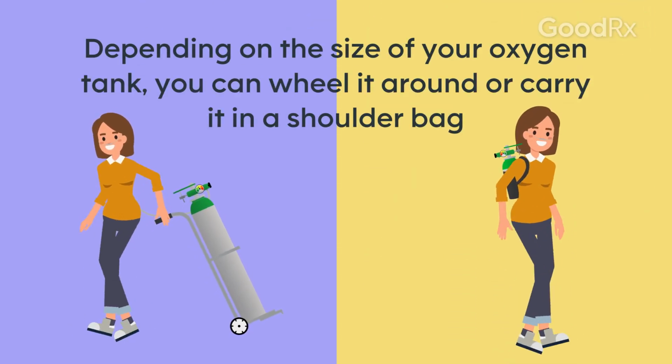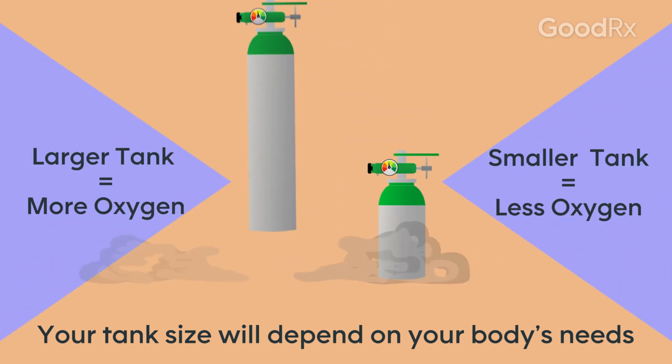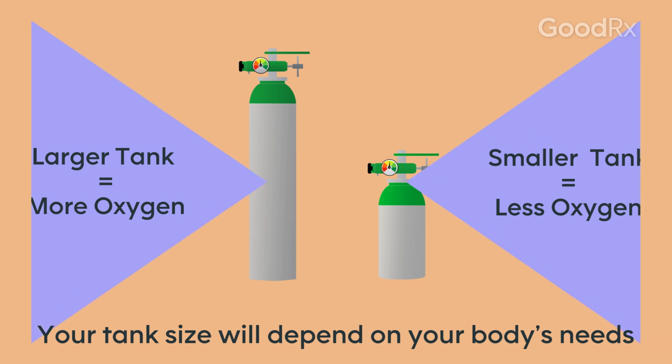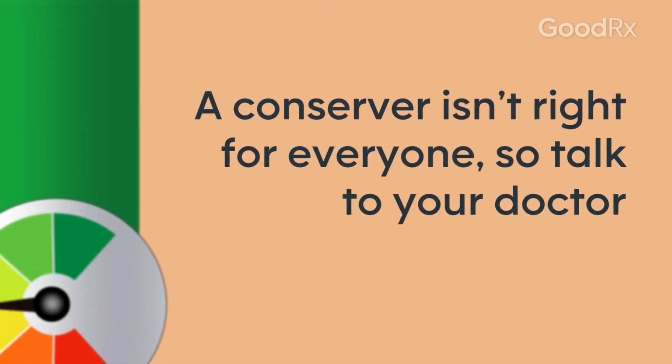Depending on the size of your oxygen tank, you can wheel it around or carry it in a shoulder bag. Your tank size will depend on your body's needs. A larger tank holds more oxygen, and a smaller tank holds less oxygen. Some people use a conserver device to help them use less oxygen. A conserver isn't right for everyone, so talk to your doctor.